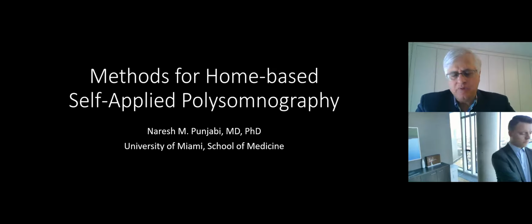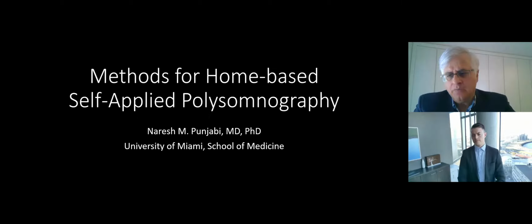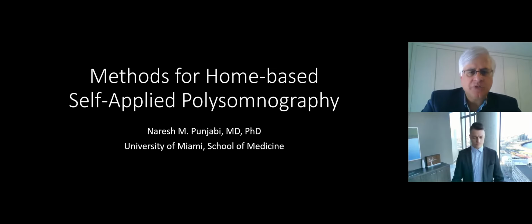The self-applied polysomnogram, which I will illustrate in the multi-center AIDS cohort study, is unique in the sense that we actually have a full EEG, which represents the frontal montage. It's unique in the sense that it can be self-applied by participants or patients. And we have now accumulated experience in over 1,000 individuals where we've been able to do this without much instruction. And not only is it feasible, as I will illustrate, it's so convenient and cost effective that it makes sense from the standpoint of application, whether it be a clinical environment or a research application.